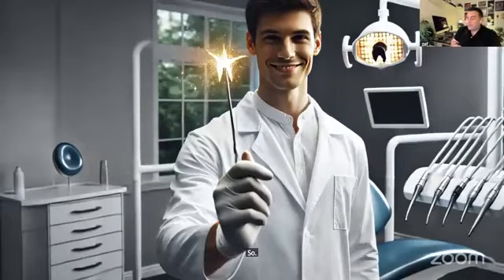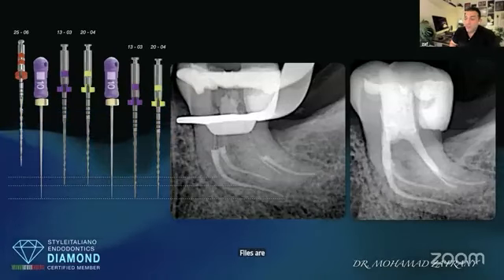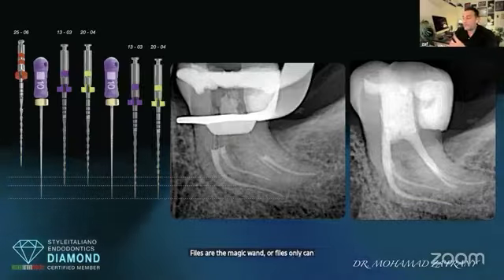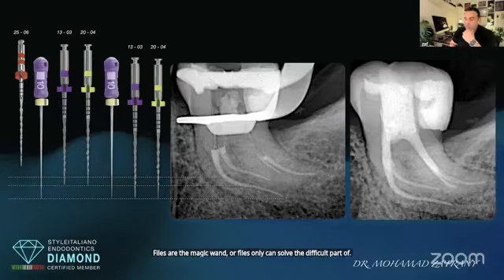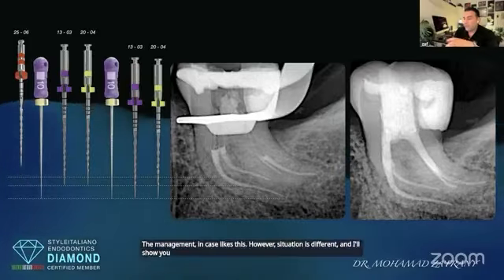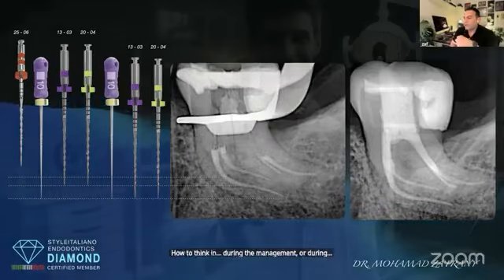So many dentists would think that in managing difficult cases like this, files are the magic wand, or files only can solve the difficult part of the management in a case like this. However, the situation is different, and I'll show you now how to think during management or during shaping of cases like this.